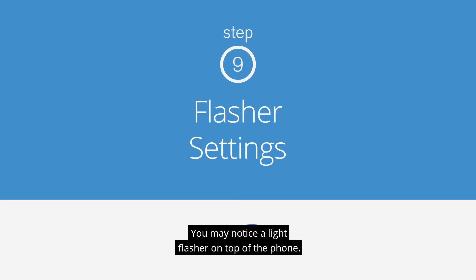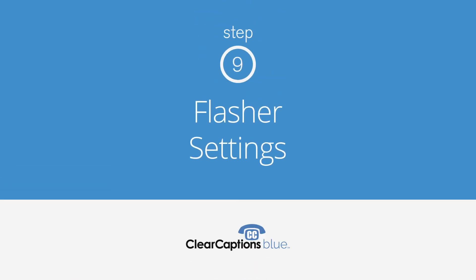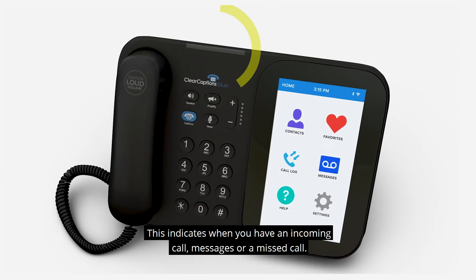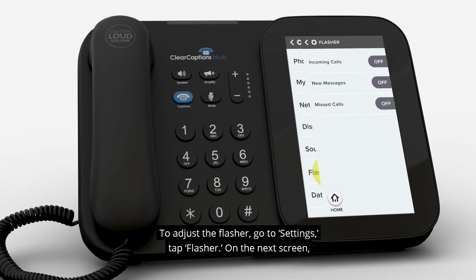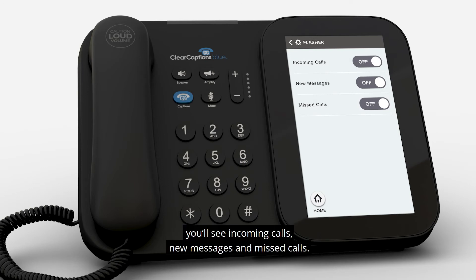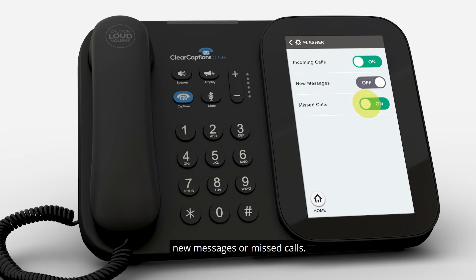You may notice a light flasher on top of the phone. This indicates when you have an incoming call, messages, or a missed call. To adjust the flasher, go to Settings and tap Flasher. On the next screen, you'll see Incoming Calls, New Messages, and Missed Calls. Tap the slider to the On position if you would like the flasher to notify you of any of these. If you would like to turn one, two, or all of these options off, simply tap the desired slider to the Off position.